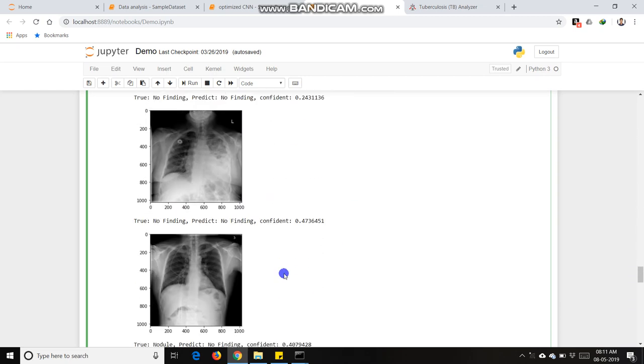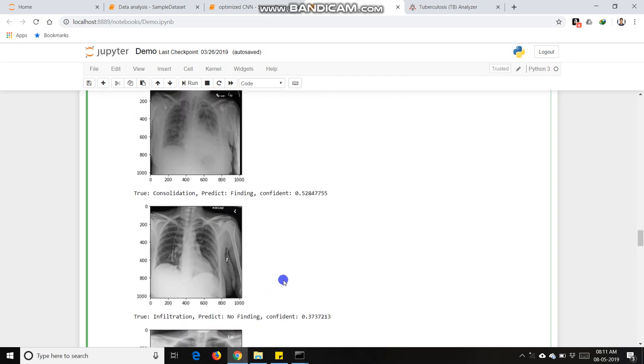In this way, this project makes prediction upon 14 types of lung diseases. We are still working on GUI of this project, but currently it's working in Jupiter notebook.